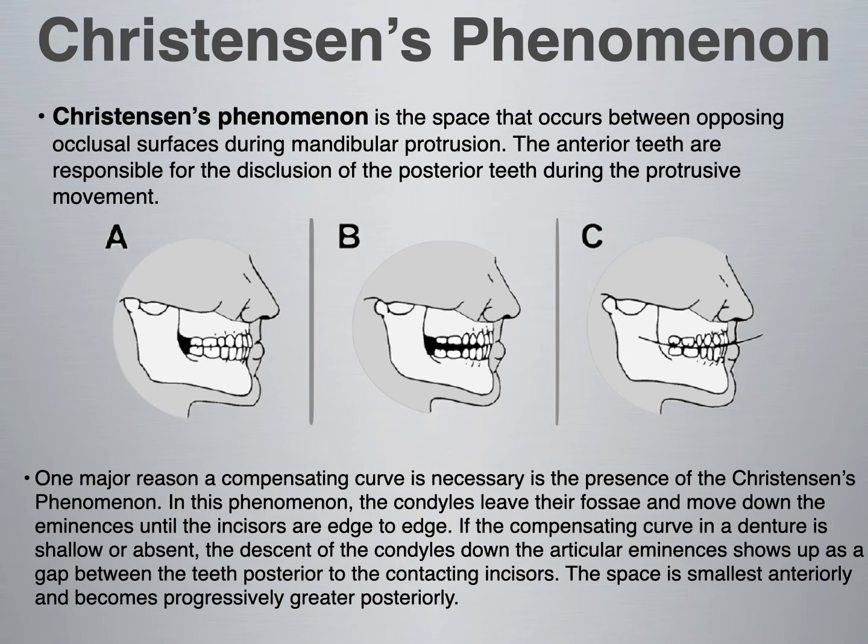So just a thought to have when it comes to denture work, how we aren't looking to disocclude areas when it comes to denture work. We're looking for bilateral balanced occlusion. We want contact everywhere during function in order to avoid the tipping of a denture or the popping out of a denture during function. Okay.